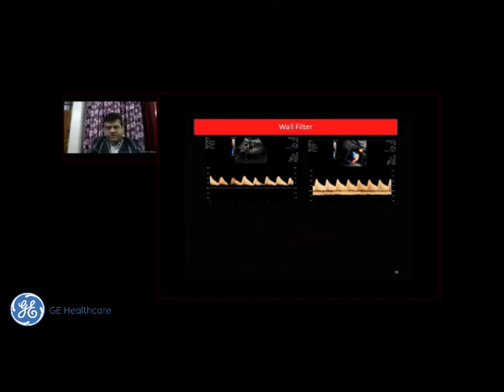Also, if you see these two, now this is the same fetus and done at probably the same time. But what is the difference? On one, you might say that, okay, this is an absent end diastolic flow in the umbilical artery. And on the other side, this is a normal umbilical artery diastolic flow. Well, actually, both are normal. The only thing is that on the image on your left side, the wall filters are too high.